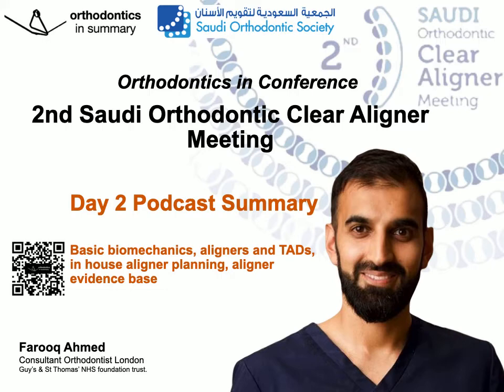Bands he found didn't really fit well when it came to aligners, so he switched to using bonded tubes with composite. He also spoke about asymmetric distalization being possible, but he mentioned as a clinical tip to avoid using class 2 elastics for asymmetric correction, as it can create an asymmetry in the mandibular arch. He then went on to speak about mesialization mechanics as well, something that aligners can struggle with.